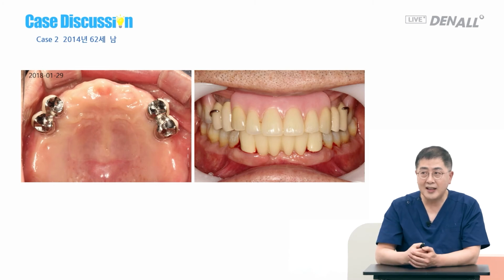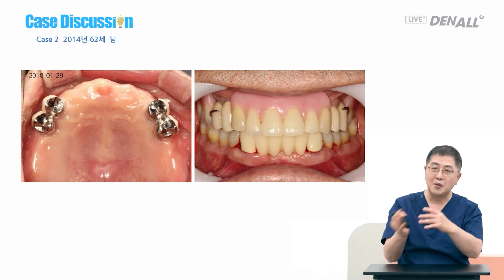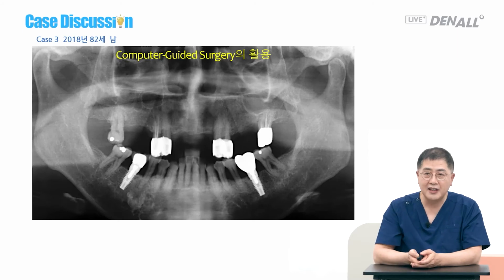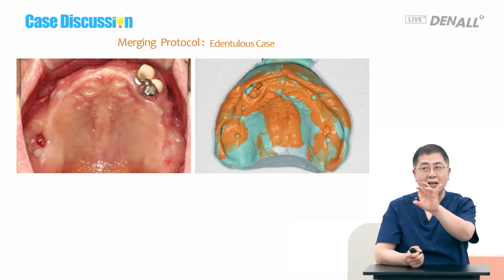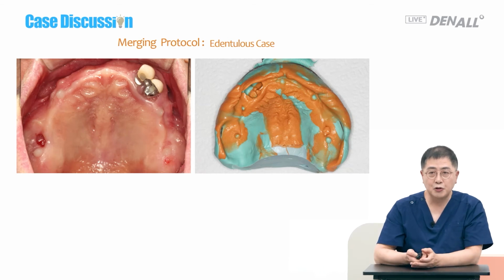62-year-old male. If someone is over 65 years of age, when there is a natural tooth, the procedure is covered by the National Health Insurance, so this can be used pretty effectively. I like OSSTEM's One Guide guided surgery system. Using the guided surgery, we can find good bone. So, 82-year-old male, teeth got destroyed and implants need to be placed. There are 2 teeth left. RPD cannot be done, so on the other side, implants are placed.